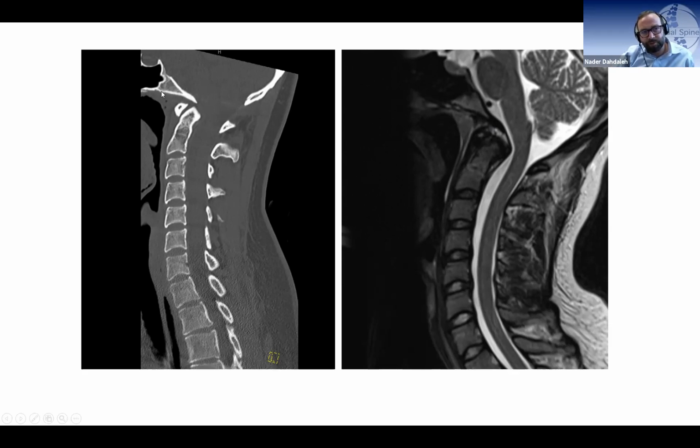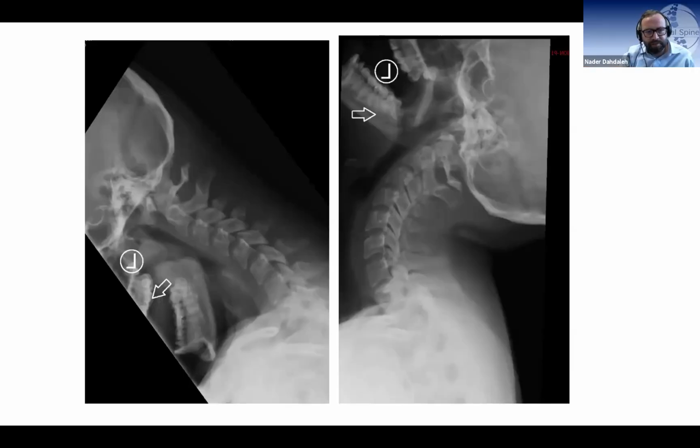You know, that's not normal. It's 130. It should be at least more than 145. So there is some kinking here. I agree with that, but certainly not a straightforward case. Right. And flexion extension X-rays, maybe mild, a touch of a millimeter subluxation, not something that stands out, okay?